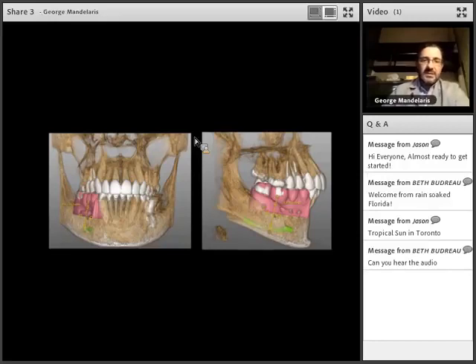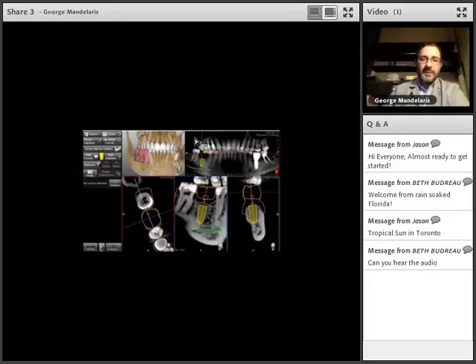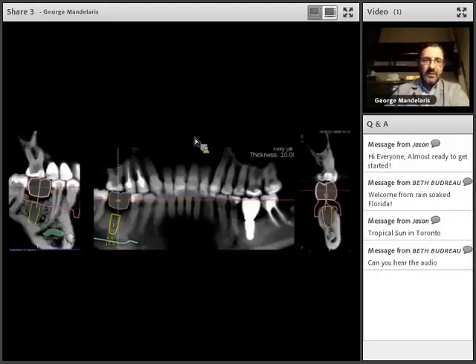More importantly, not so much mesial, distal, buccal, lingual, but vertically, because I want to make sure that the implant is at the right vertical position to give the prosthodontist enough running room, enough emergence profile to really make this tooth look like a tooth. That's one of the shortcomings I think with surgery, that sometimes we tend to plan and place the implants a little too shallow, and we don't give the prosthodontist and the restorative dentist enough running room to really create ideal emergence profiles. So based on that digital diagnostic wax-up, I'm going to map out the virtual tooth, plan the implant, and once that's been planned and all the accuracy checks have been okayed, we'll move forward.